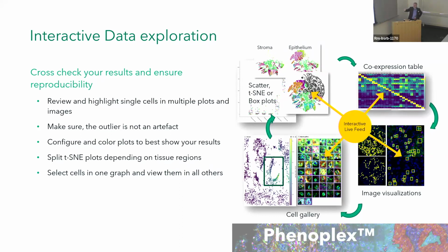What's very exciting about this is that if you have more than one image, because I don't want to analyze one image at a time, it will pool all of the data from all of the cells that you've analyzed, so that as I'm gating on cells, it could come from various images. And in a multi-view, I'm able to see the relationship of all of those cells across multiple images, not just one image at a time.